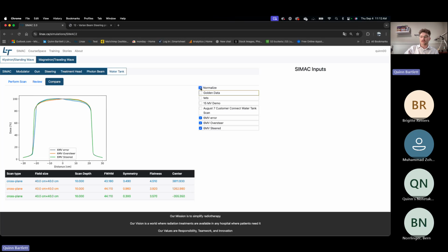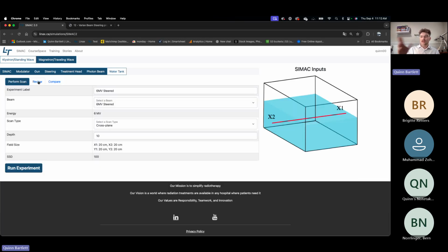And then, I mean, they're pretty already normalized, but then you can just see the differences. And then if we wanted to plot more depths, or different energies and compare them as well, then you could come here and compare all that. So just, yeah, in a quick, little 10-minute run through, that's kind of how we do beam steering or teach beam steering. That's directly on the simulator.